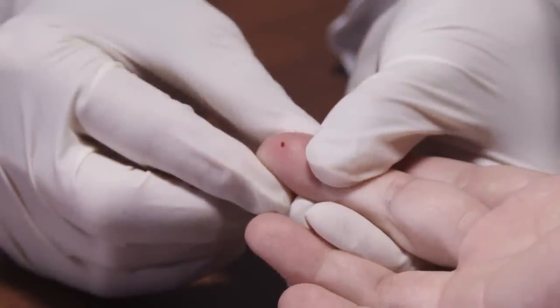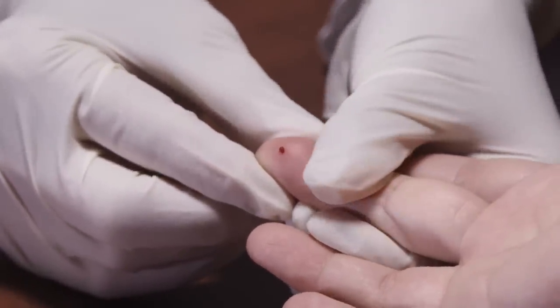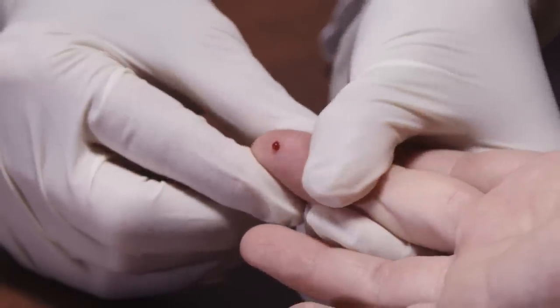If not enough blood is generated from the drop, repeat previous steps by gently squeezing the finger until another drop of blood forms.